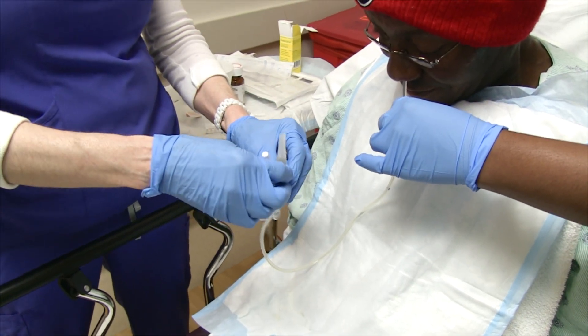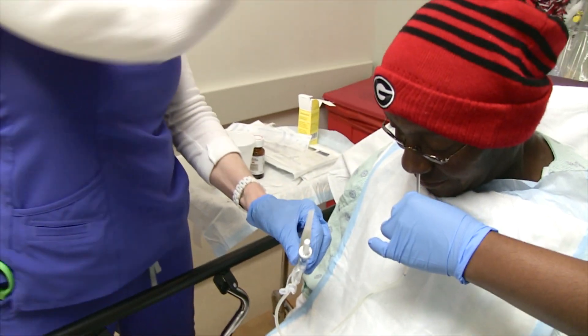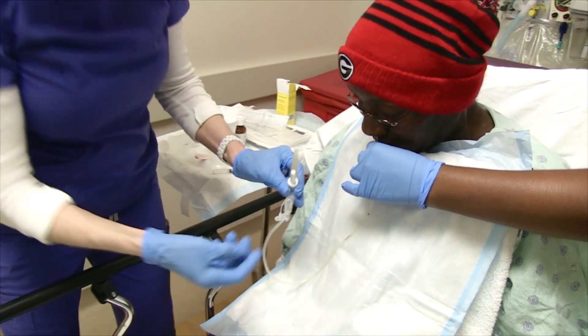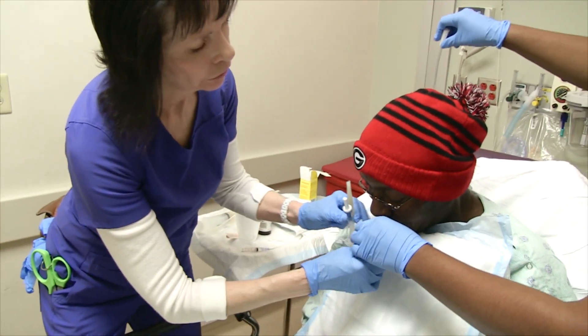As a general rule, I would have him connected to a pulse oximetry. He can speak — you can raise your head up.